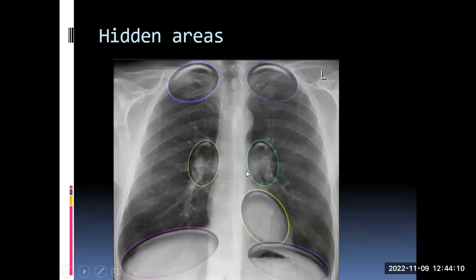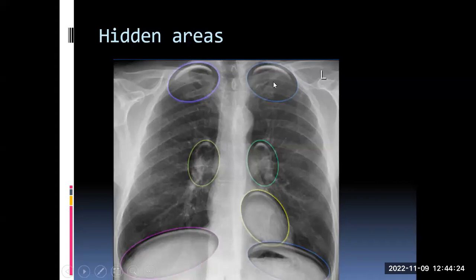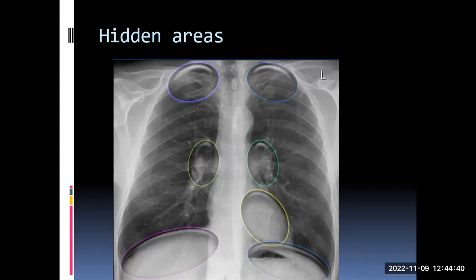There are hidden areas in a chest X-ray. Most pathologies will be staring at you in the face, but certain pathologies require you to go actively looking — especially the apices. If you don't look at the apices for pathology, you might miss a Pancoast tumour or an apical pneumothorax. Also the hila are very untidy in an X-ray because of too many overlapping vessels and structures, so our eyes tend to avoid that area. If there is any hilar peribronchial thickening or bronchiectasis, you need to actively look at the hila and check if the angles, sizes, and densities are normal.